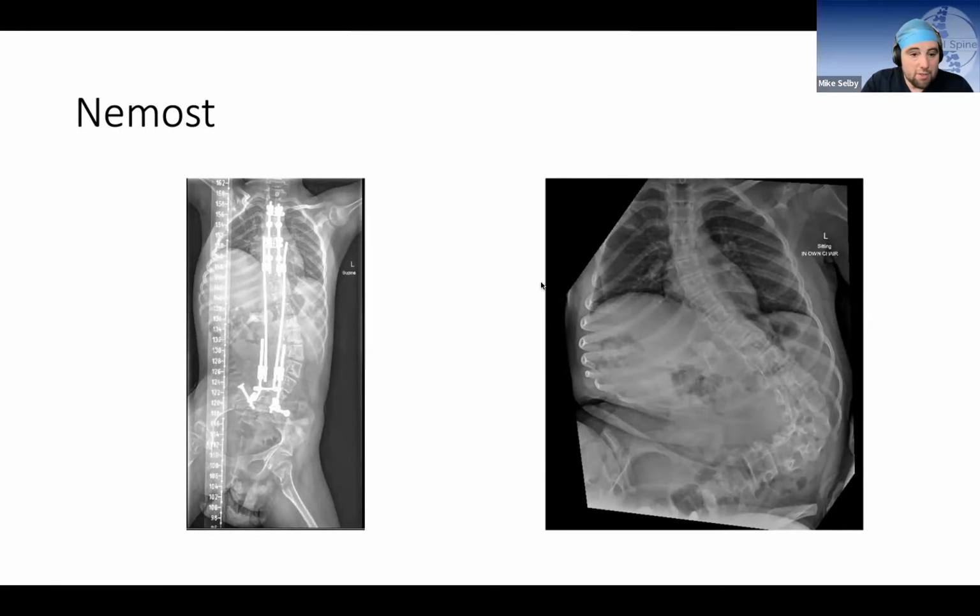Yeah. I mean, I think there's got to be applications there for adult spine correction when you go into the pelvis, but that hasn't quite been worked out yet. I do think as well, when you look at the early series from Australia, not yours, there have been some issues with pelvic dysplasia in these kids and malposition of that screw that goes really towards the apex of S1. And I think the general advice would be, fair to say, try to do it with navigation for that particular screw. Would you agree with that?